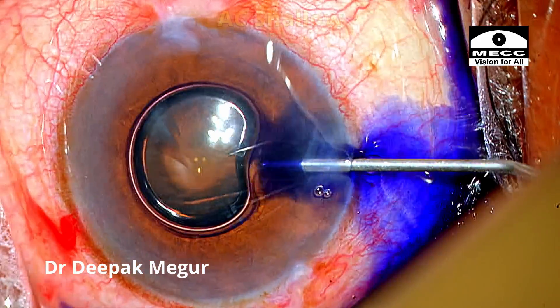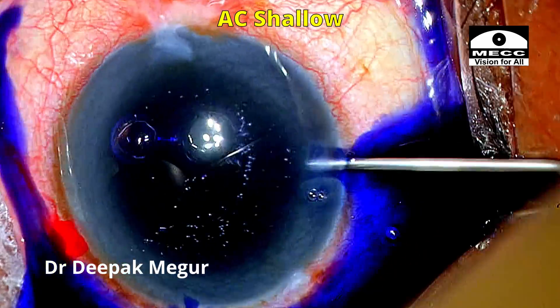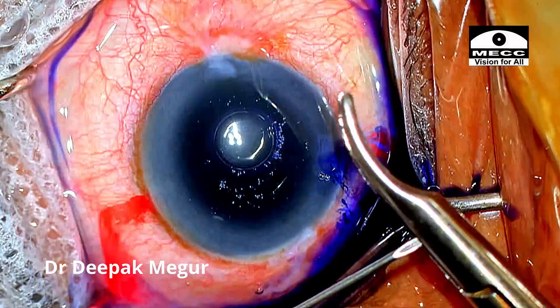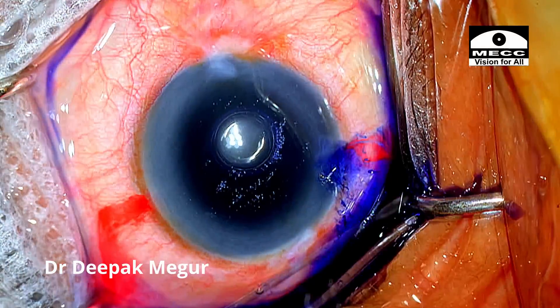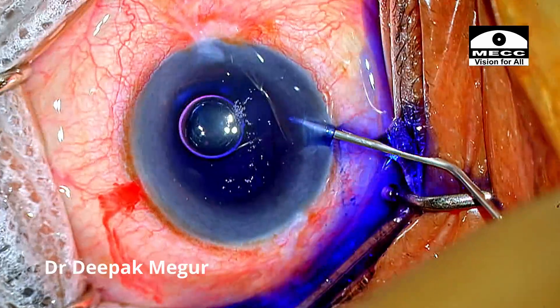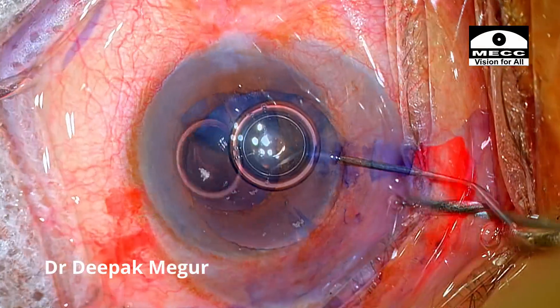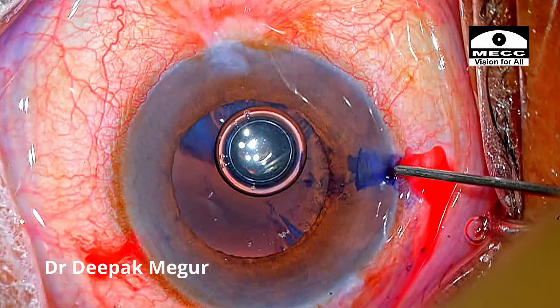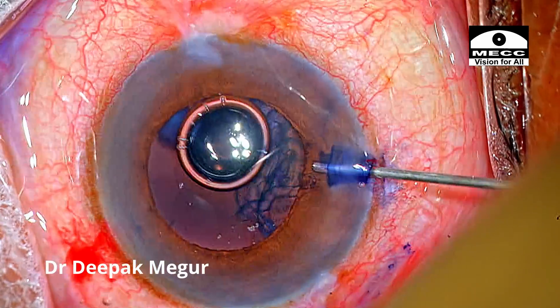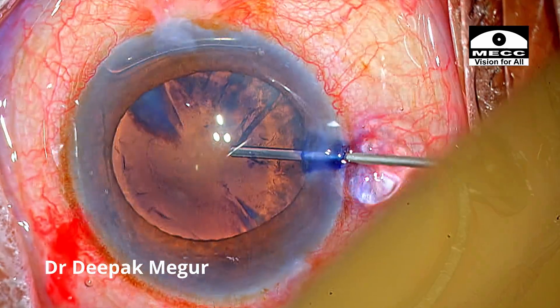As I'm trying to put in the dye, you can see that the chamber is shallowing and the iris is trying to come out — this is a cause for concern. I bend the needle and irrigate out the dye. Before making the main incision I always want to pressurize the anterior chamber using OVD — I'm using viscoat in this case.